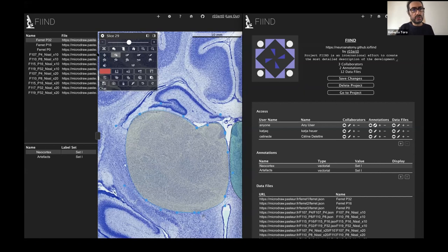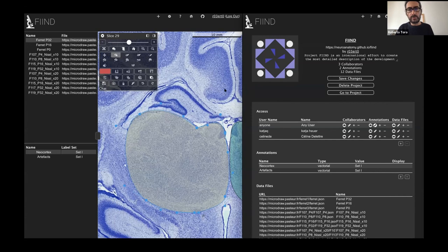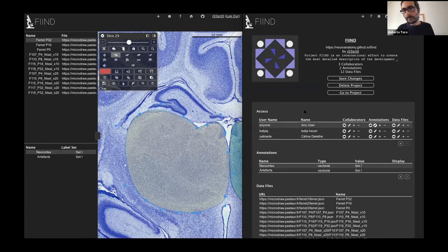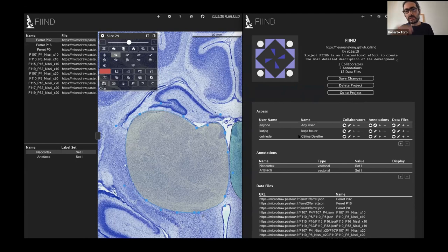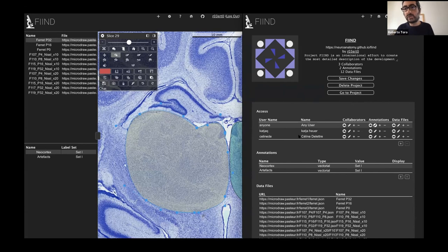You see on the left the ferret brains that we have made available on the web at the moment and then you see a bit of the interface for annotation with all the different tools and the configuration window where you can define a project, the data and the collaborators you want to have and also the access, the visibility of your project if it's public or private.